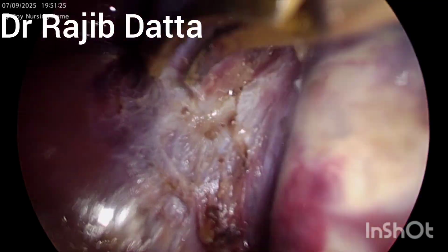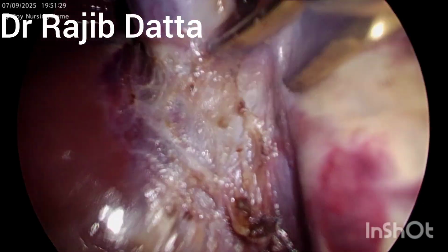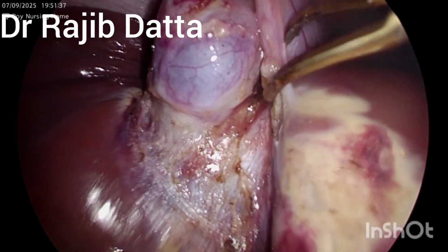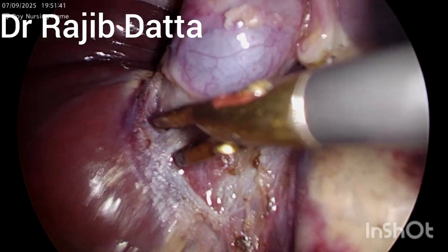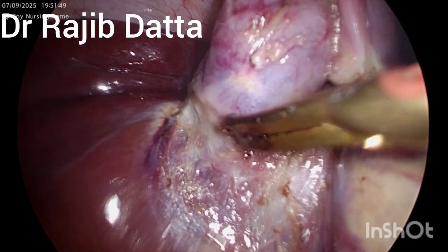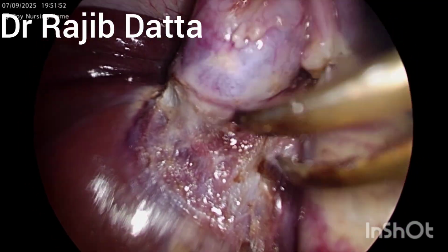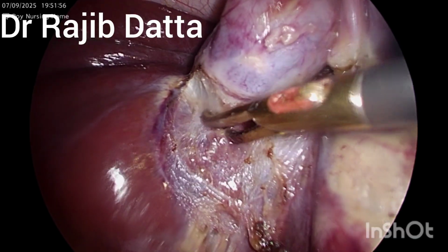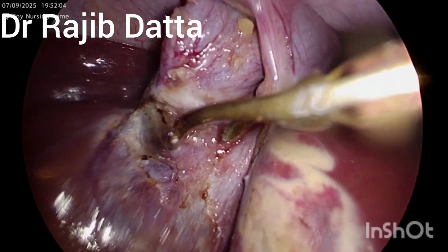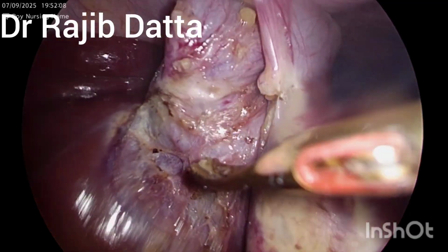So small bites, and don't go towards the liver, otherwise liver injury may happen and liver sinuses may open up. So small bites, and the tip is directed towards the gallbladder always, so that inadvertent injury of the liver can be prevented.